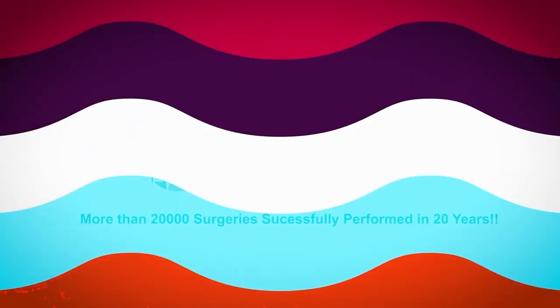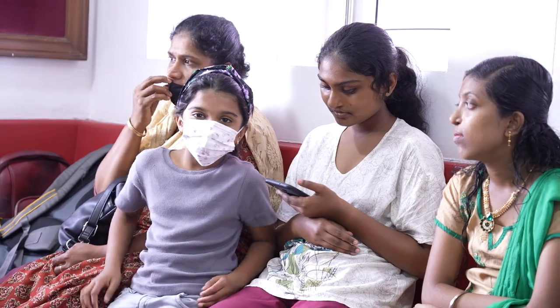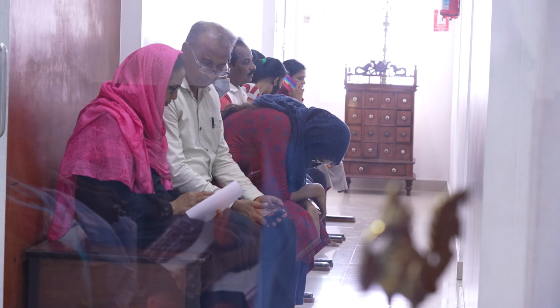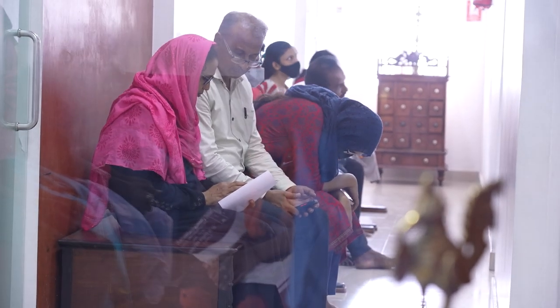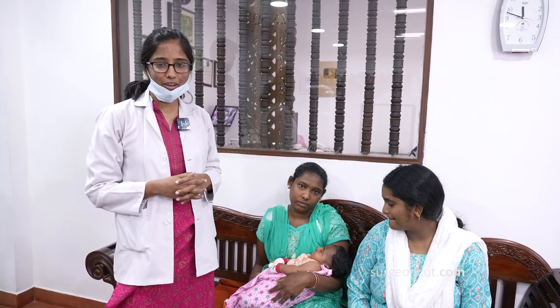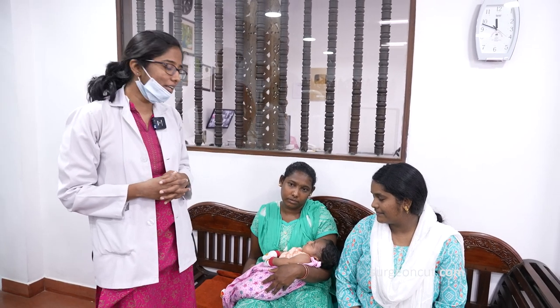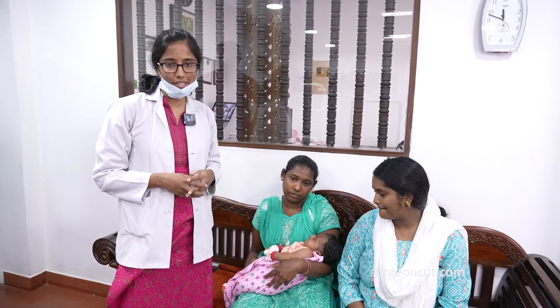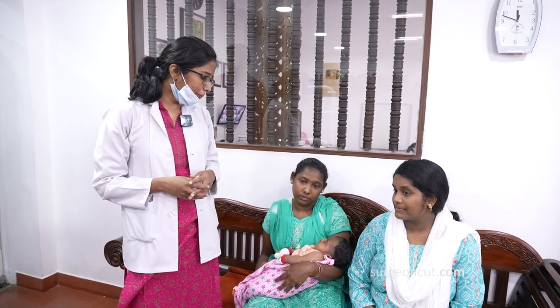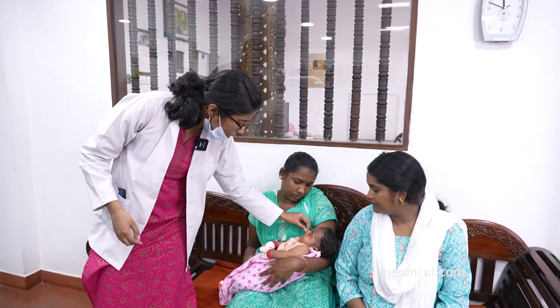Let's get started. Here we have this baby with a unilateral cleft lip, alveolus, and palate. The baby is almost three months of age and scheduled for a cheiloplasty today. This surgery should take us less than an hour. They are also going to create a vestibular fold — a vestibule — because the prolabium here is attached.